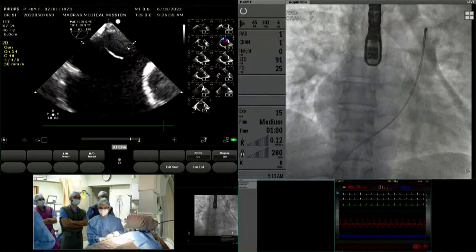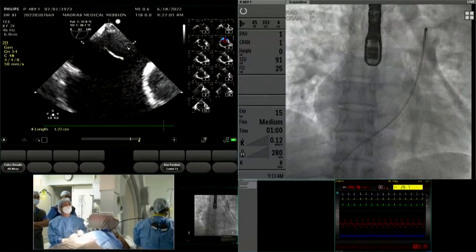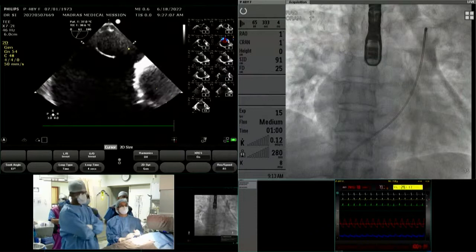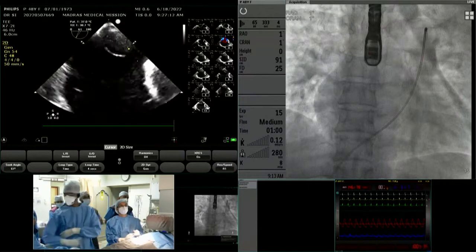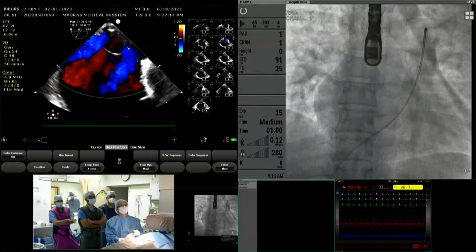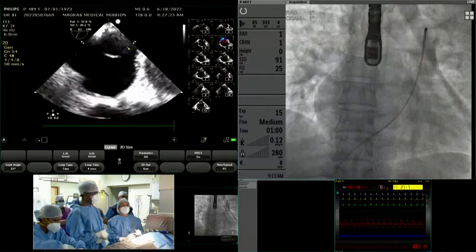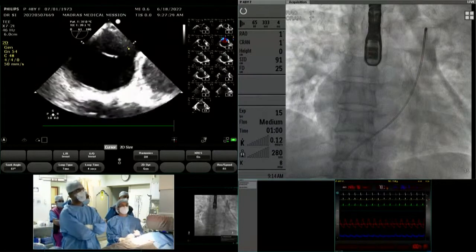The tissue in between was measuring 13 mm when we measured in the OPD. Again, we can see it's around 12 mm here. And the anterosuperior defect measured around 19 millimeter and the posterior defect measured around 12 millimeter in the OPD. We can see both the defects now with the color. This is the anterosuperior and this is the posteroinferior defect separated by a tissue that is larger than 7 millimeter. So we will close this with two devices.